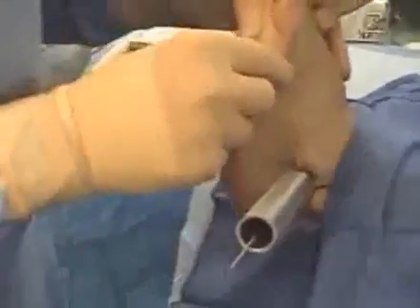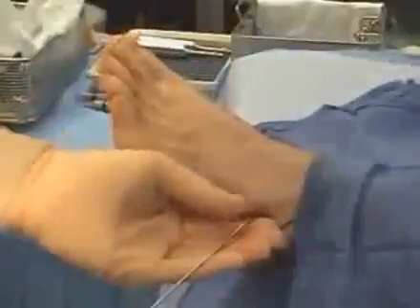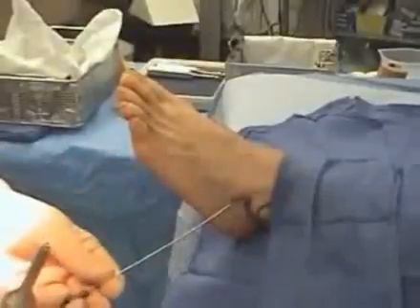So again, here's the size 7. The most commonly used stents on the market are the size 7 and 6. So just remember that if you're up around the 9 or 10, then something most likely is wrong. Although you will need to use those once in a while, but not too frequently.